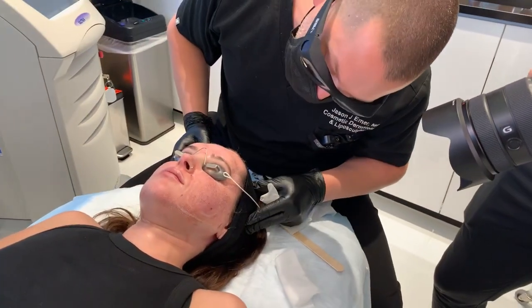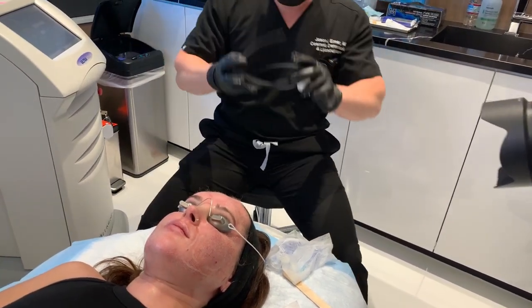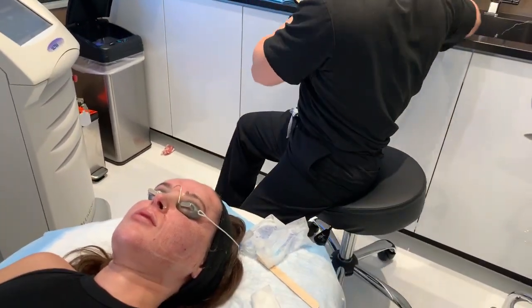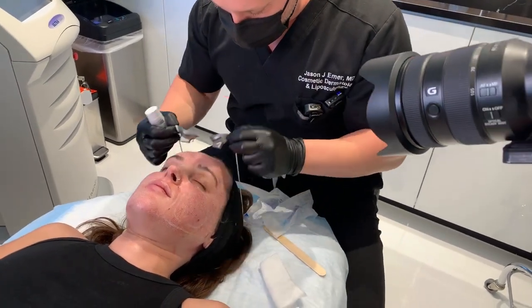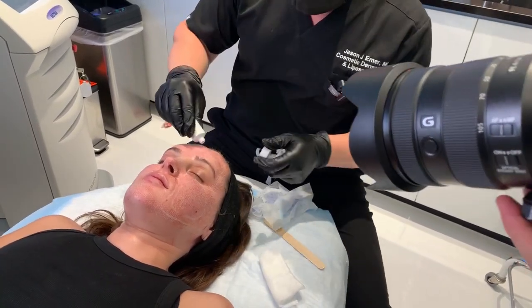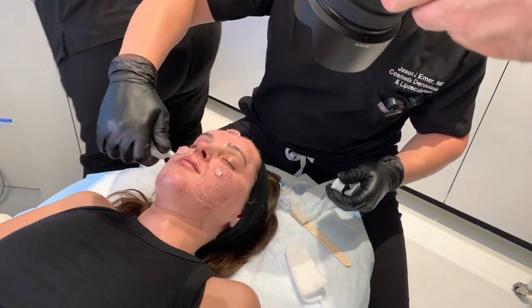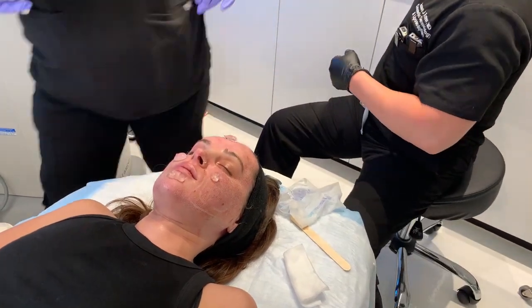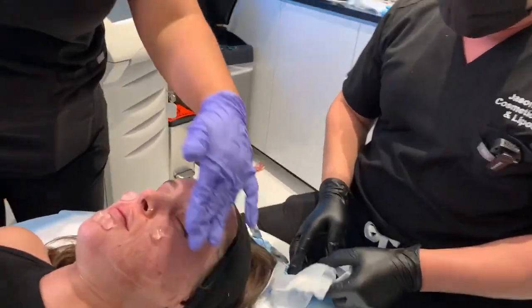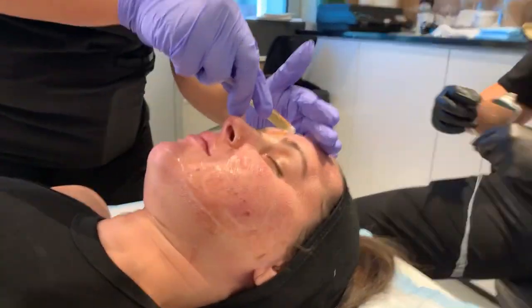Okay. That was good. Now, we're going to go to healing. So we're going to microneedle here, PMT, so keep your eyes closed, okay? Just so it doesn't get irritated. I'm going to put a lot of hyaluronic acid. We also combine this with Emerage Skin Hyla B and PRP. And we're going to place that on the skin. We're going to get her really, really moist. We want to protect her skin barrier.